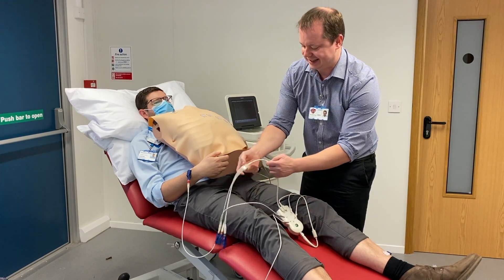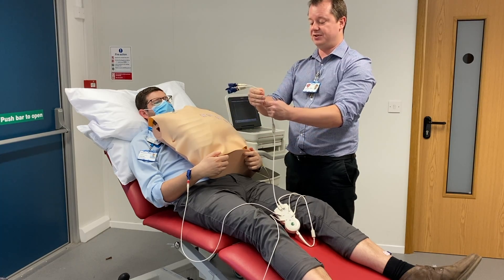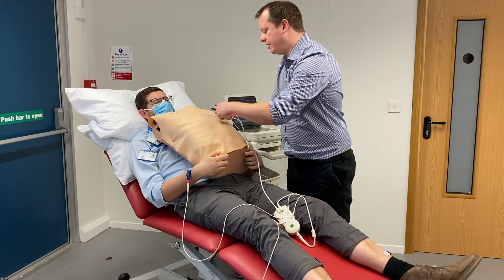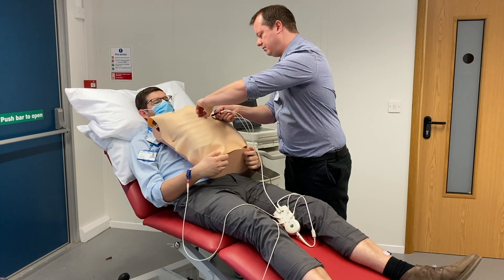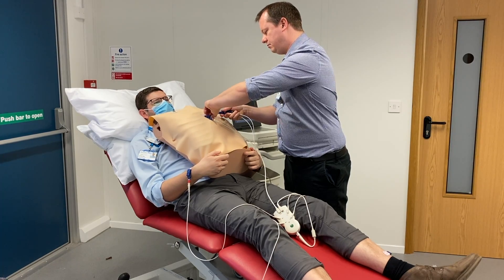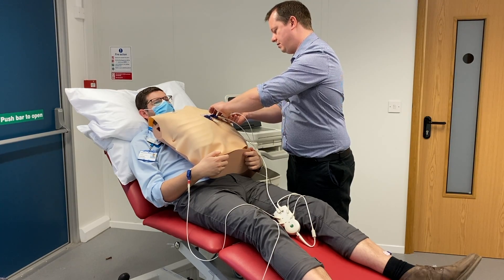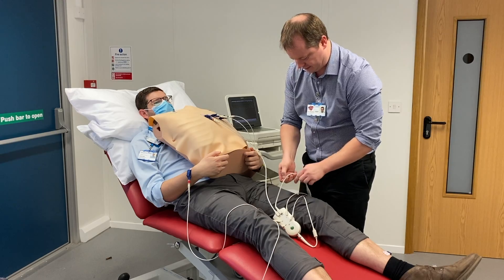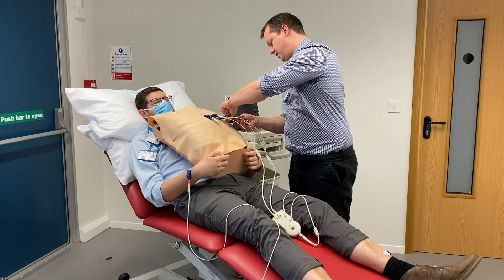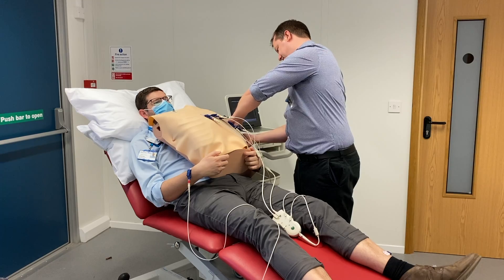Then we have our chest leads, which also have a colour order, but luckily these ones are always numbered. So you just literally put them on one to six: V1, V2, V3, V4, V5, and then V6.